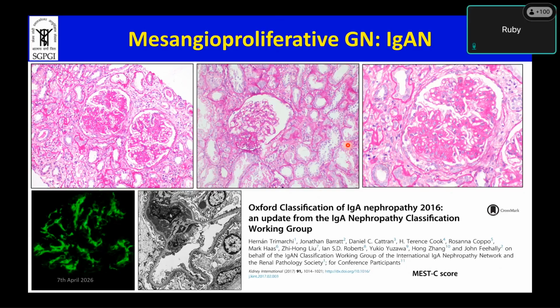If there is tubular atrophy, you give T1, and T2 is more than 50% tubular atrophy. Very good. So if we look at the tubules, it will be T1. Of course, you're not seeing the whole biopsy in this, but it was T1. Okay, and you have IgA deposits. Of course, if you do an electron microscopy, you will find mesangial deposits, right? These will be the mesangial electron dense deposits that you see.